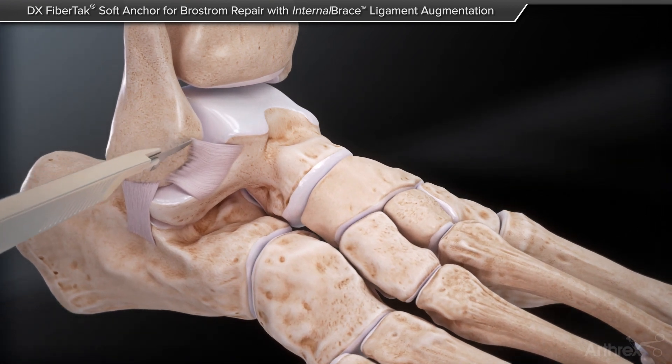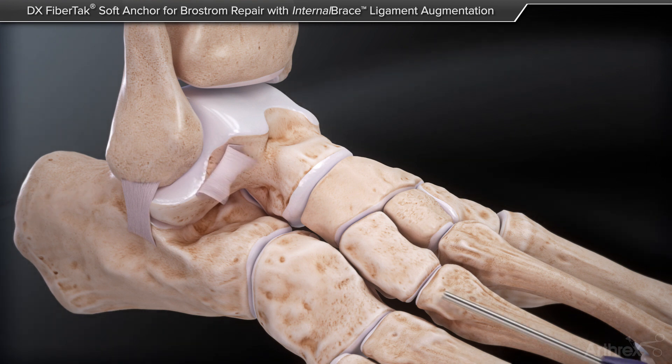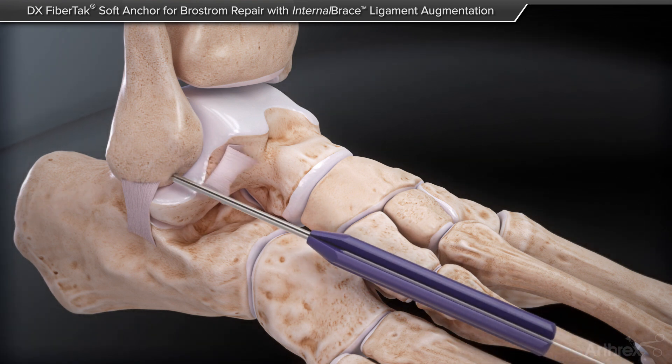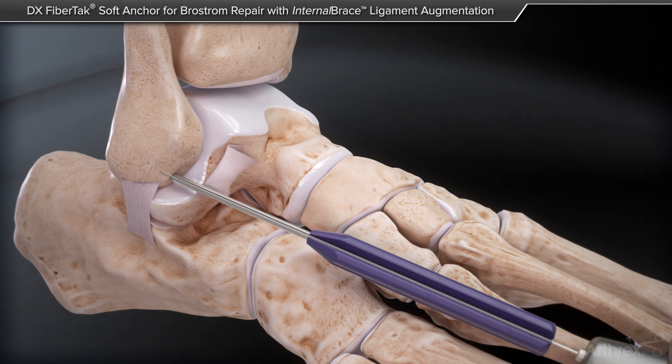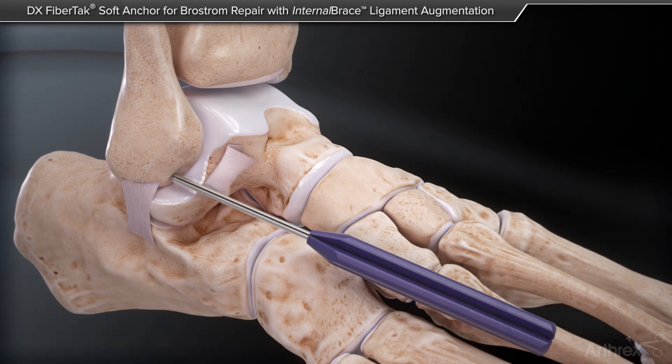Measuring about 1 cm from the distal tip of the fibula, utilize the FibreTac drill guide and a 1.35 mm K wire to create a bone tunnel. The drill should be inserted to the automatic stop at the back of the drill guide as shown.